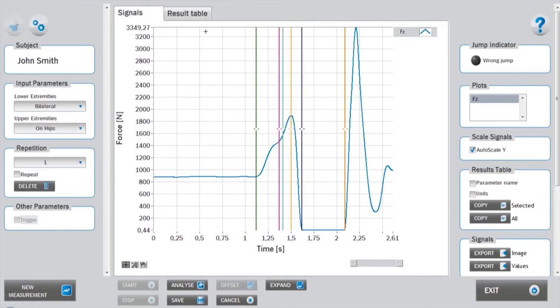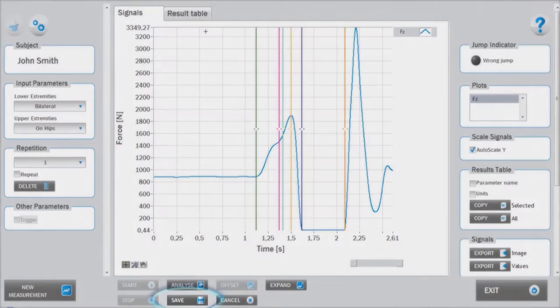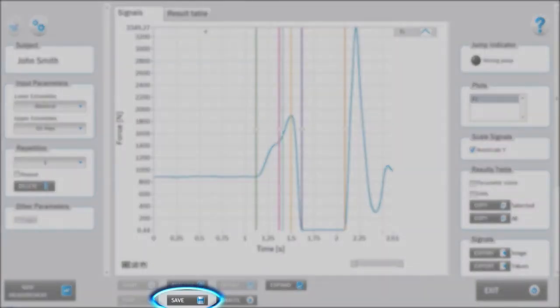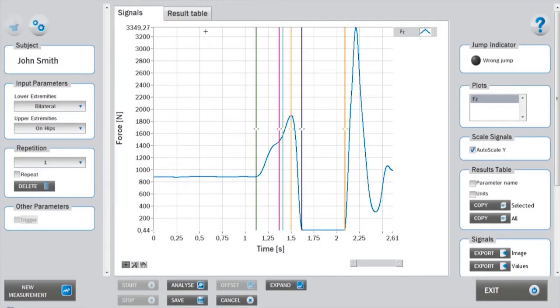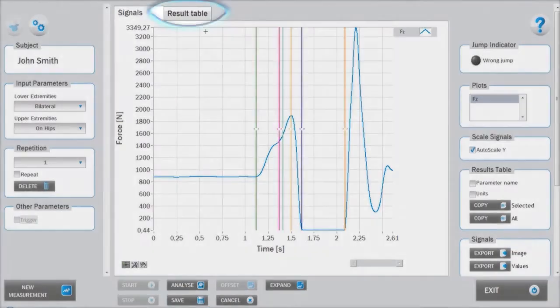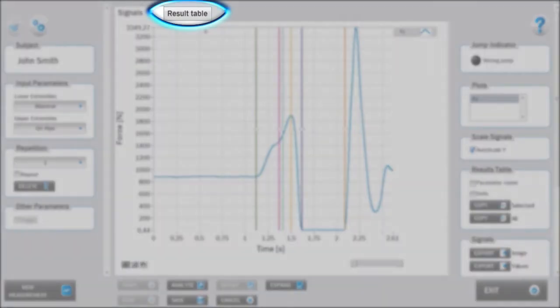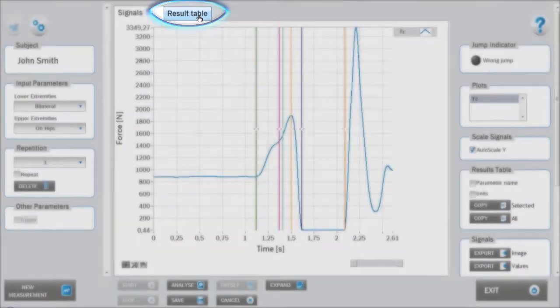If the cursors are repositioned, the new analysis can be saved as a new measurement by pressing save. The data from the analysis can be viewed under the results table tab.